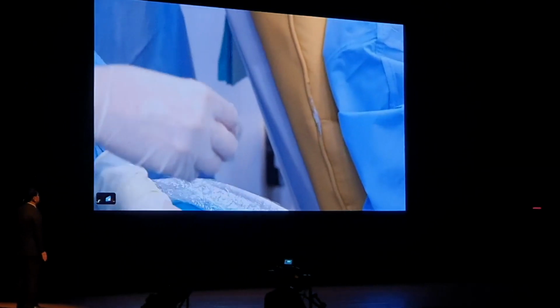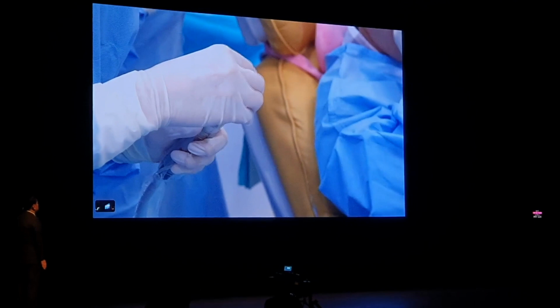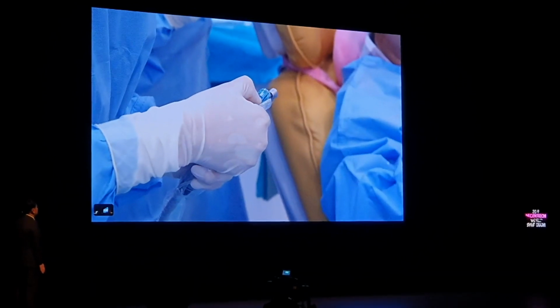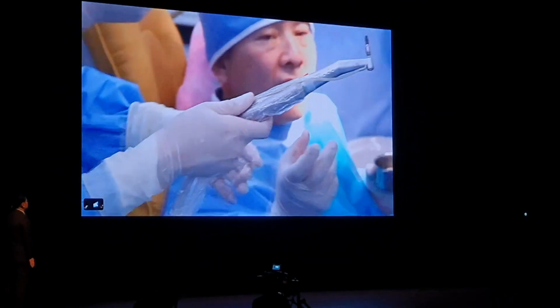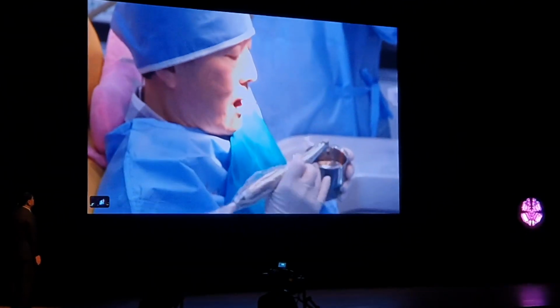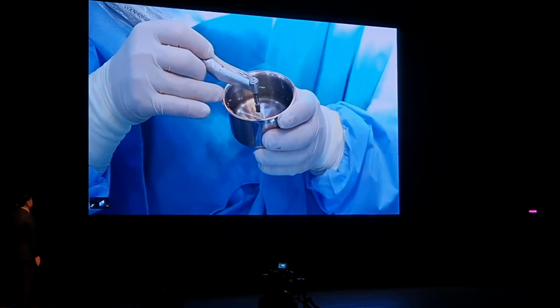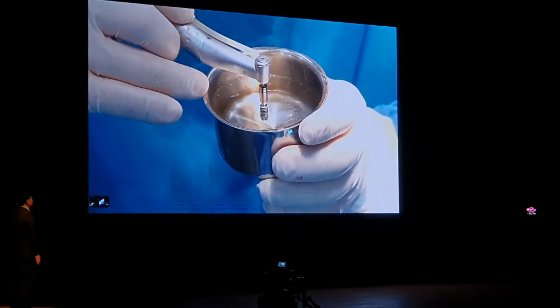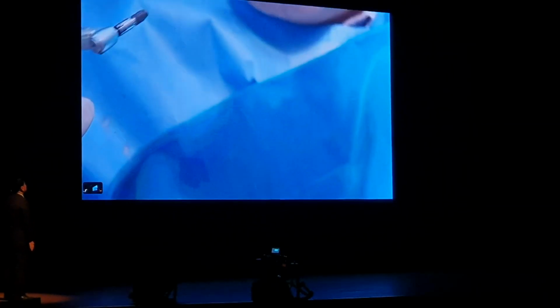It took about 32 minutes from pre-guide indexing up to this point. You can find the timer running on the screen to your right side. Just past 33 minutes. The implant is removed after 45 seconds, so taking out the implant from the device. Right after coming out from the osteoactive, the implant is being connected to the engine. It completed with surface treatment. If you can zoom in a little bit, the surface immediately pulls up water to the top. So we see that very clearly.